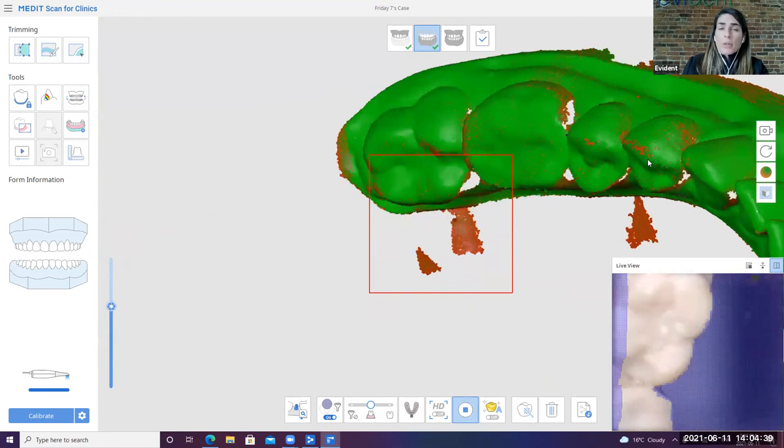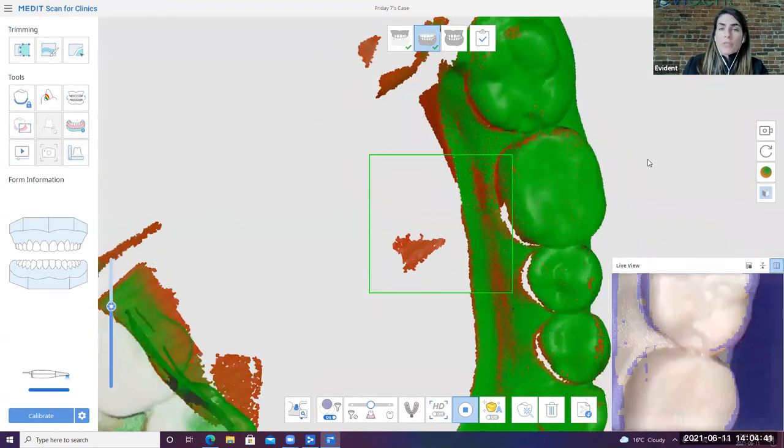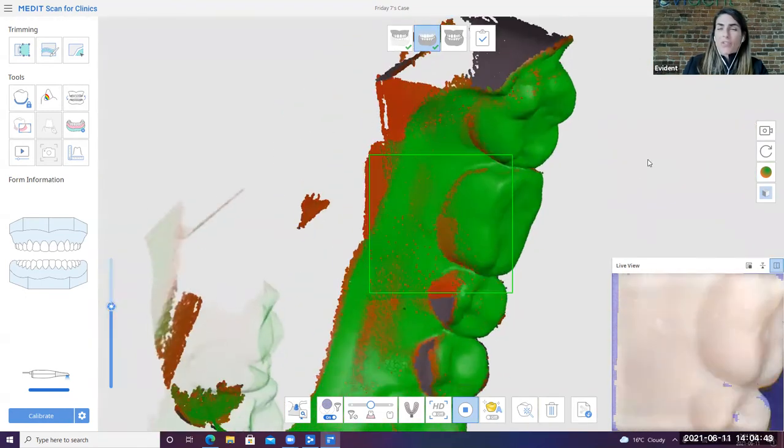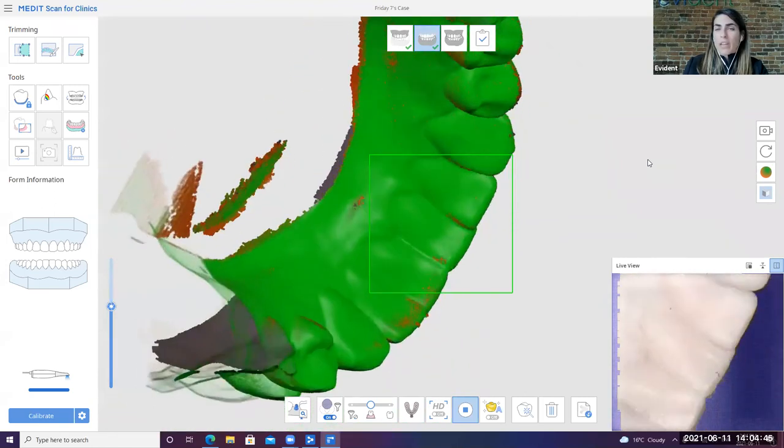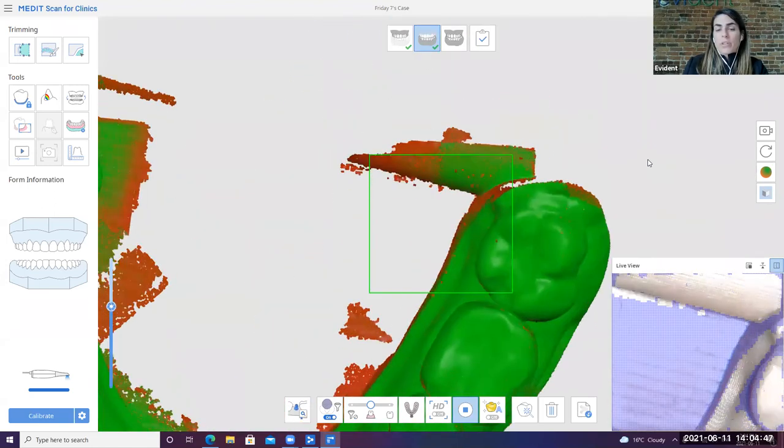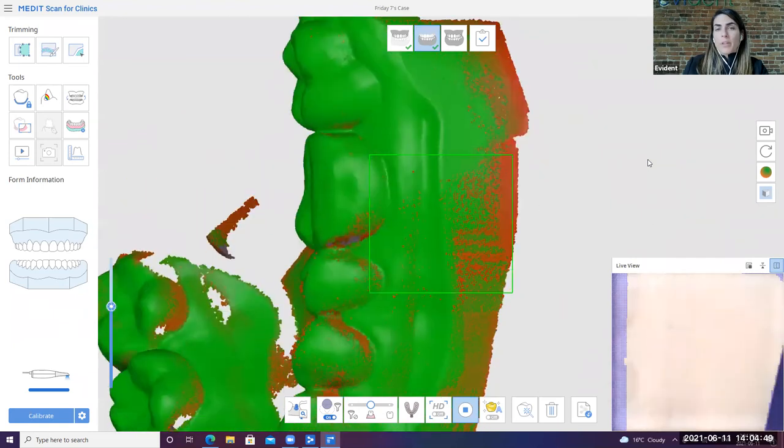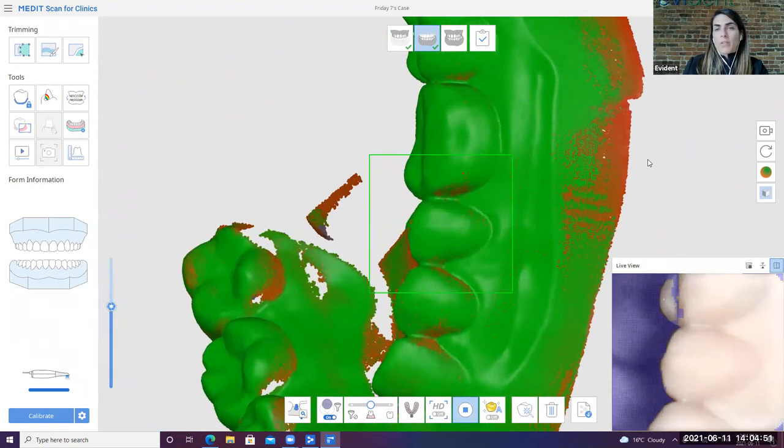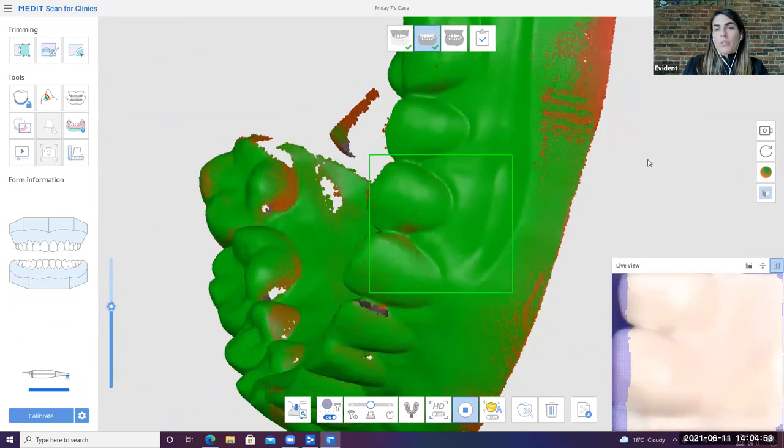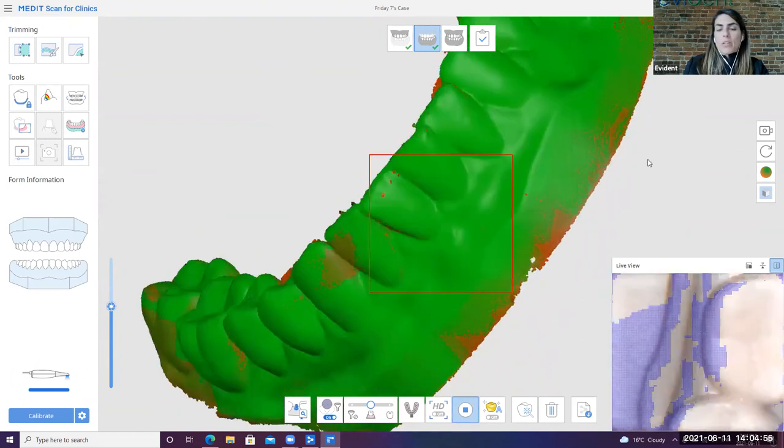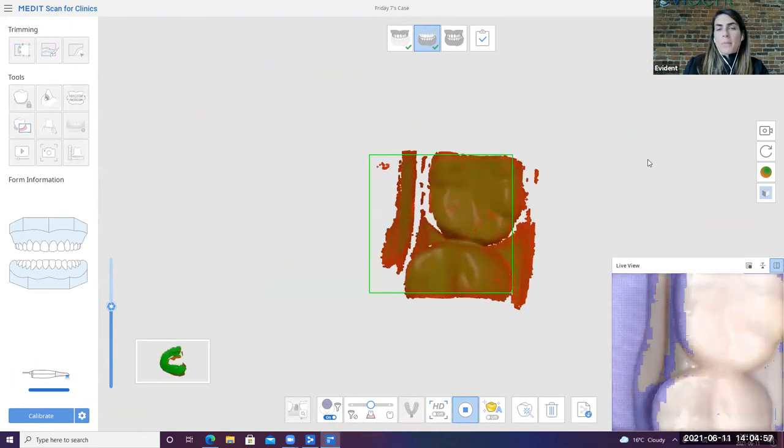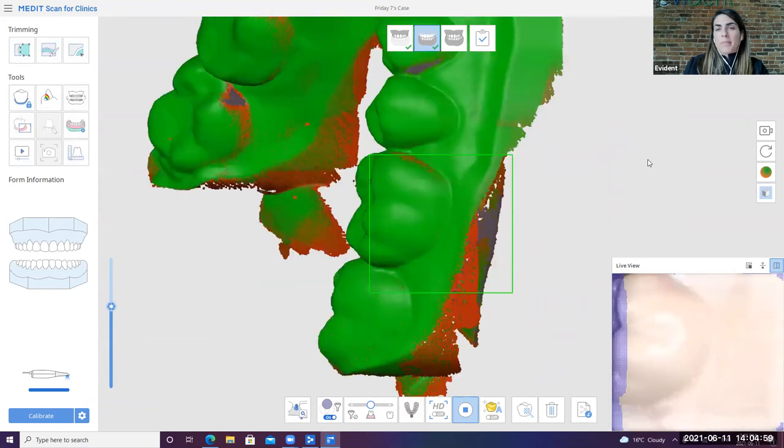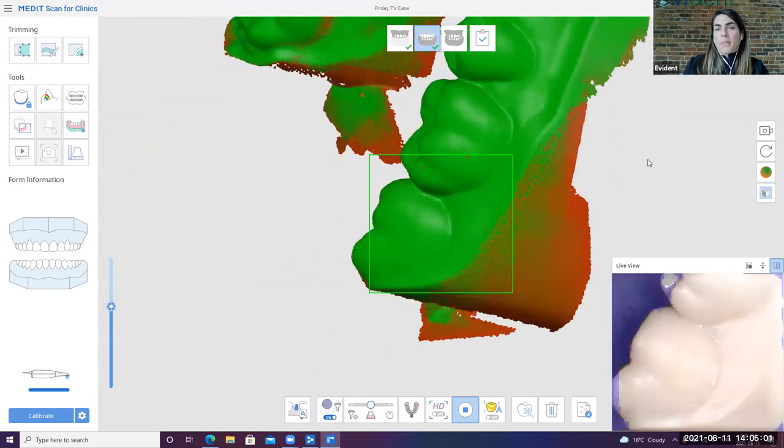You can actually also pretty much touch the teeth when you're scanning, which is really helpful. So there isn't like a super magical hover like a lot of the other scanners out there in order for you to ensure that you're capturing the data properly. I'm just going to make sure that these interdental spaces here are well captured and then double check on this side too.